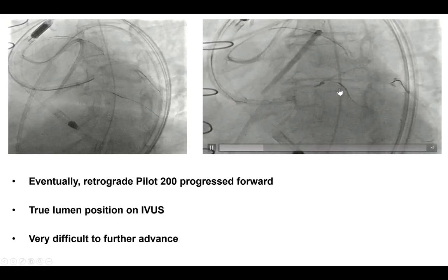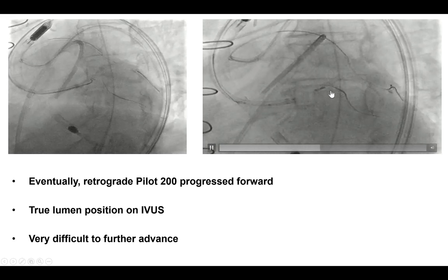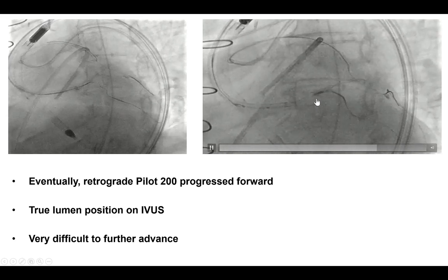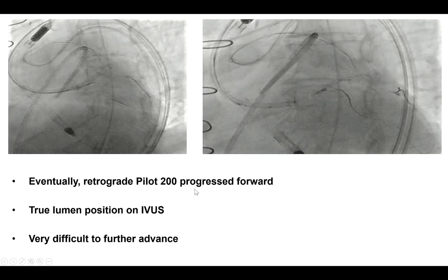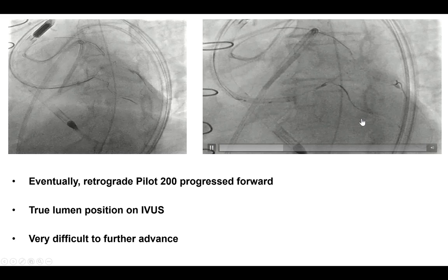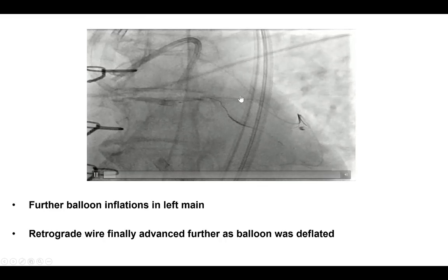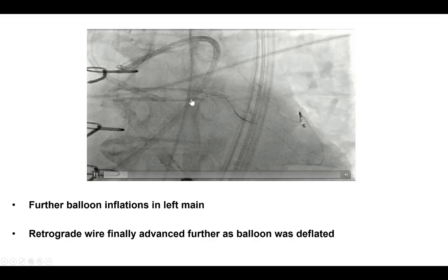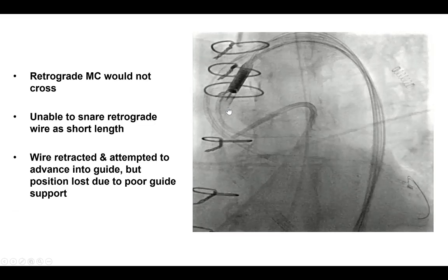After multiple attempts and multiple guide wires, a Pilot 200 wire did cross into the left main, as confirmed by an IVUS we had placed into the left main — we can see it jumping in. However, we could not advance the retrograde microcatheter. We did more balloon inflations in the left main and were able to further advance the retrograde wire, but still could not cross with the retrograde microcatheter.